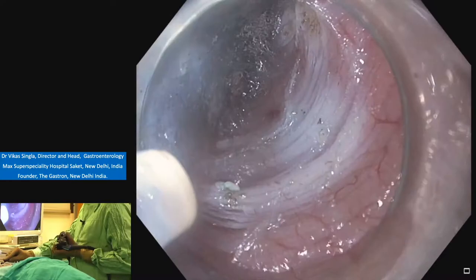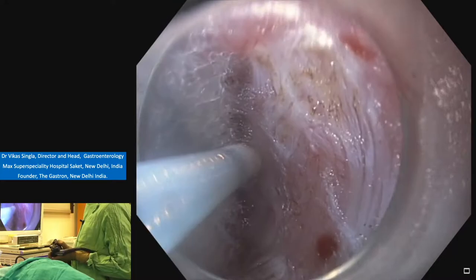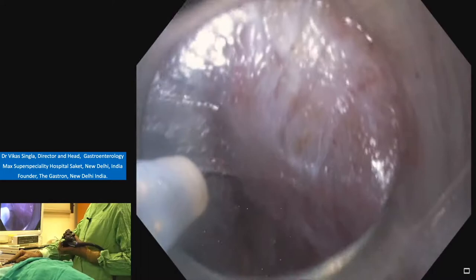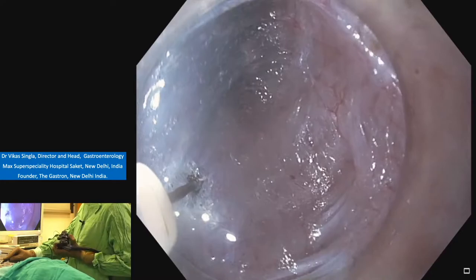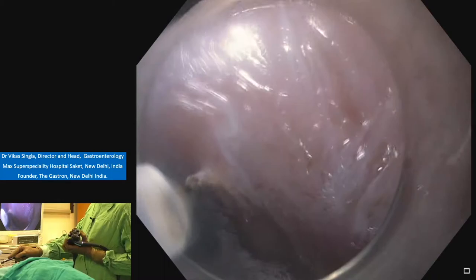Dissect the fibers. Again. Dissect the fibers, inject more fluids, inject fluid, again dissect on the sides so that we have a wider tunnel. Inject, lift, going from one side to another side. So it's the same step repeated.